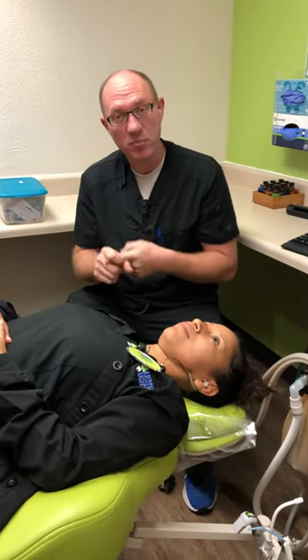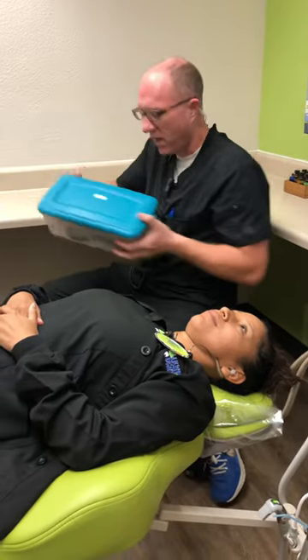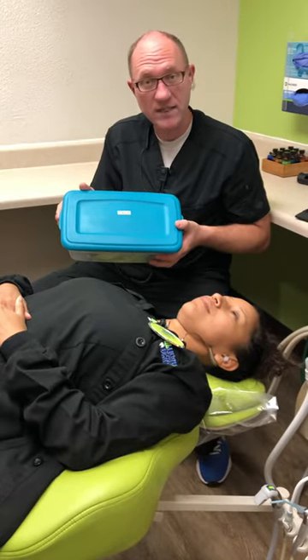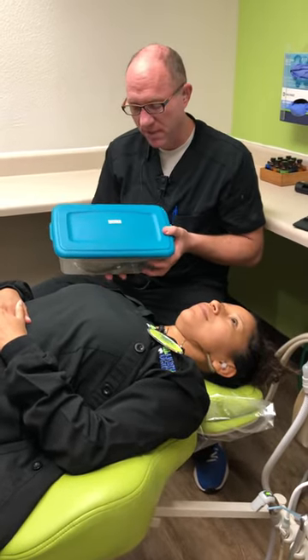If we have a patient in the chair who's having a breathing issue, one of the first things we need to do is give them supplemental oxygen. And if they stop breathing, we'll be calling for our emergency equipment and the containers to come in. One of them is the Airway 1 box, which we have in each of the offices, located underneath the sterilization stack where the sterilization equipment is.